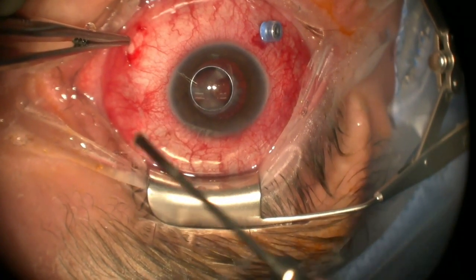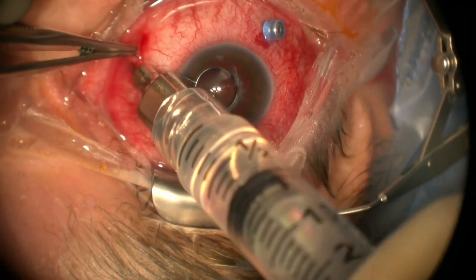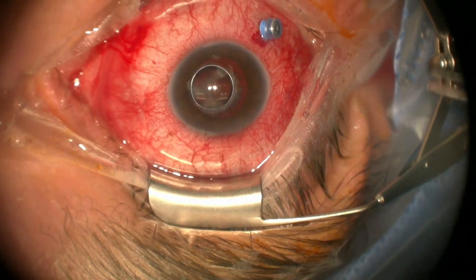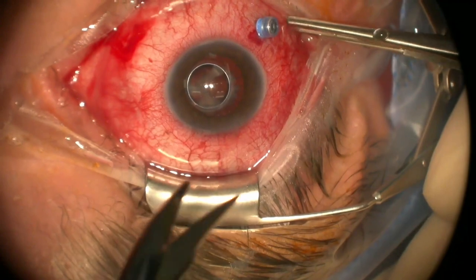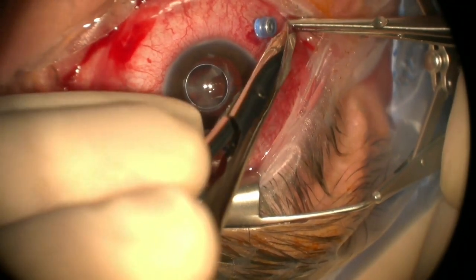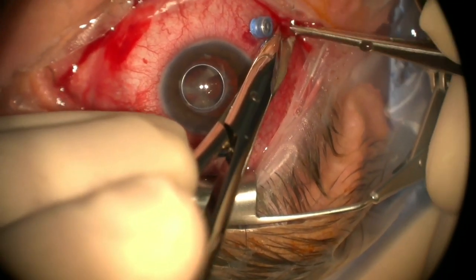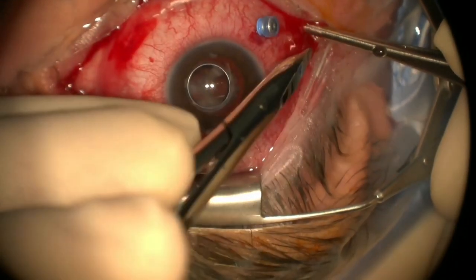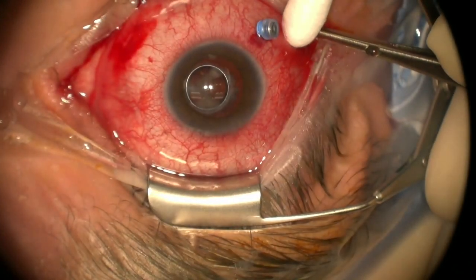And then we got a blunt cannula here, 19 gauge, same solution. And we like to put that right back there. And we'll do one more cut down spot. I like to do 2 scissors. And is any block left in that syringe? That was pretty miserly. I have like a half CC left. Same technique. We like to cut down. Spread a little bit there.